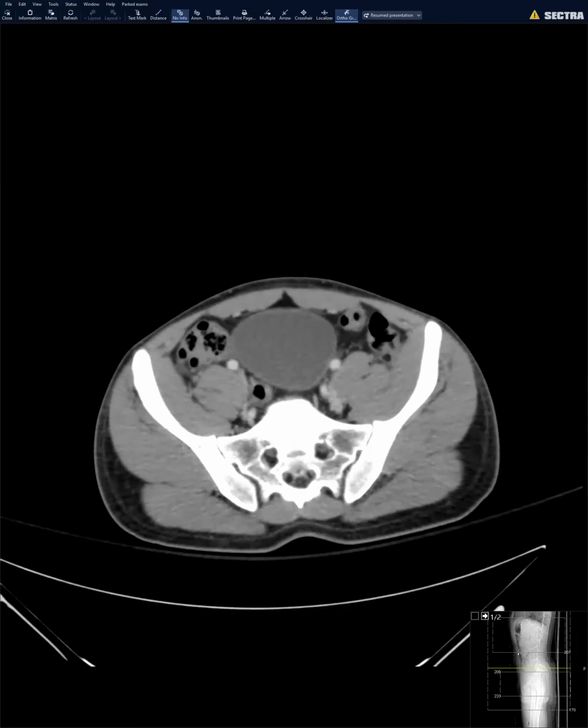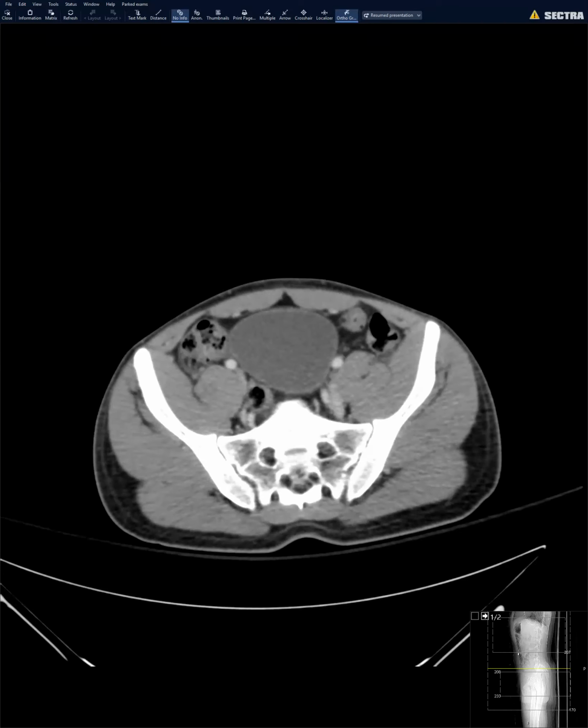So this was a young patient. Oh, sorry, can I make a quick comment? In our program, we do have a very developed endometriosis program here, and the other thing that I came to learn is the value of ultrasound in evaluating DIE. I don't know if you guys have much experience, but we have one of our radiologists who reads ultrasound, Scott Young, who is like a pro at this, and there are pretty significant deep maneuvers that he does to look for DIE using ultrasound. It was actually pretty phenomenal.